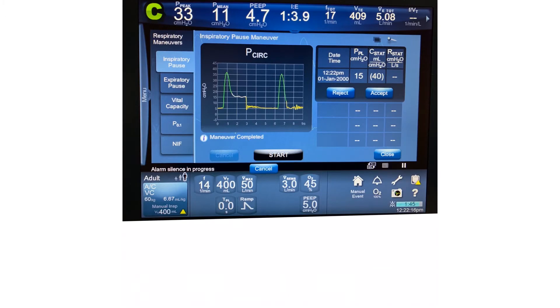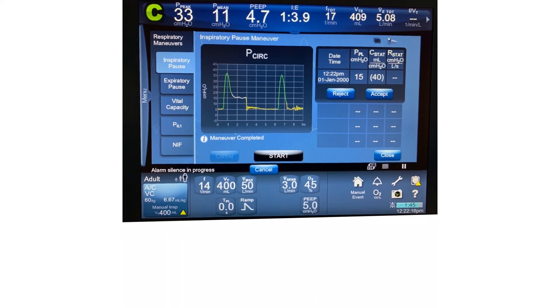Hello. The other day we had a lady in our ICU intubated for severe encephalopathy to protect her airways. As you see here, she was placed on VC (volume control) mode, assist control, with flow trigger.